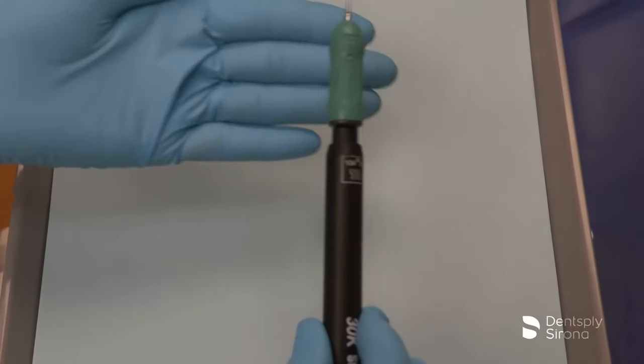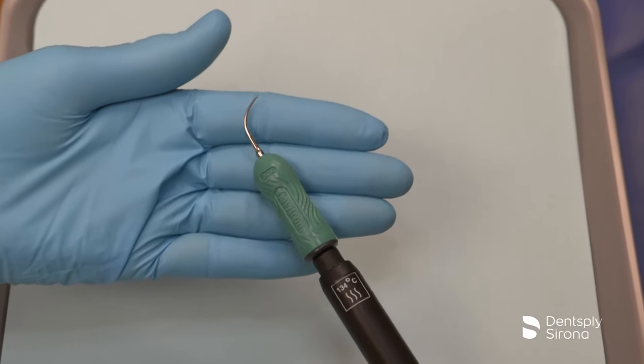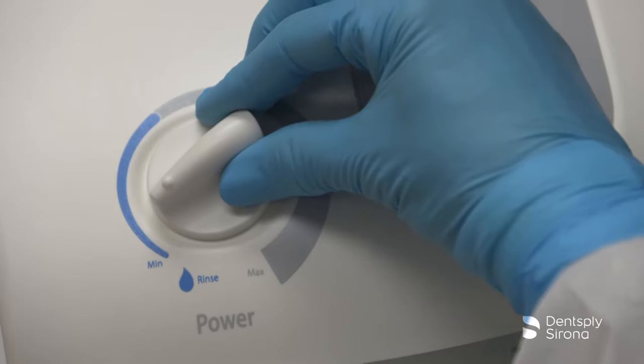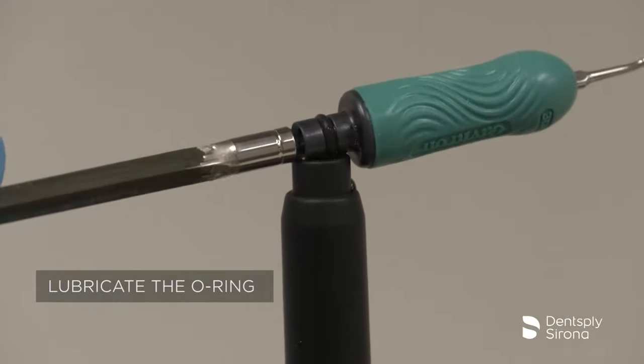This is the Cavitron FSI Slimline 10. It is designed for removal of light to moderate calculus and deplaquing, and should be used at low to medium power levels. After the clinician has filled the handpiece with water, seated the insert, selected the power, and adjusted the spray properly, instrumentation begins according to the treatment plan.